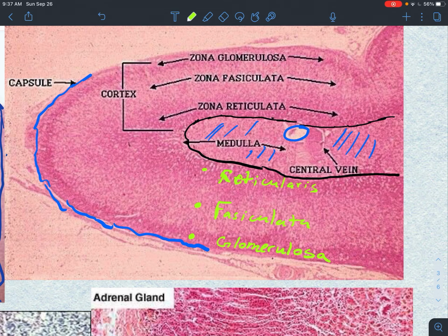So those are your three options, and that's how the pointer will be. I'll go ahead and draw a line there. You'll either have a pointer doing this, or a pointer doing this, or a pointer doing that. And the other thing to notice is, of course, that this is going around in a circle.